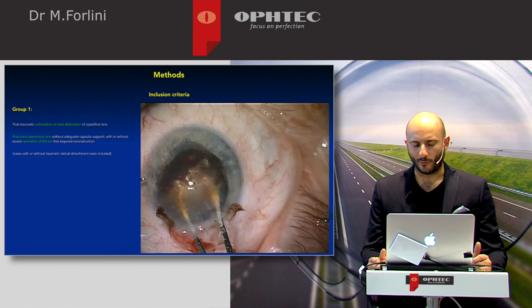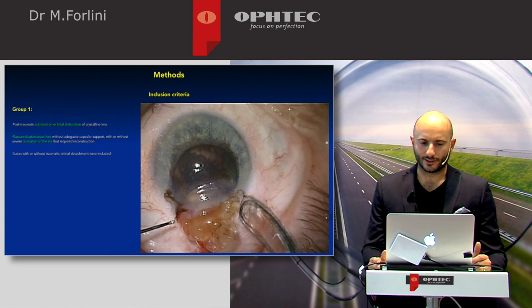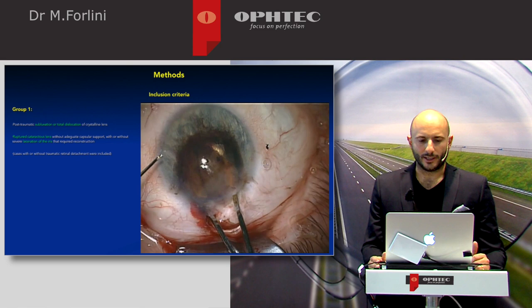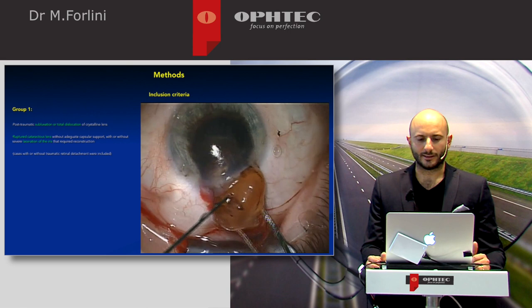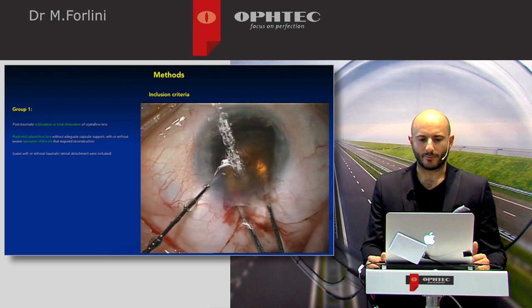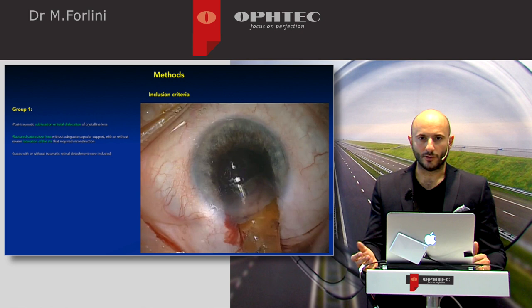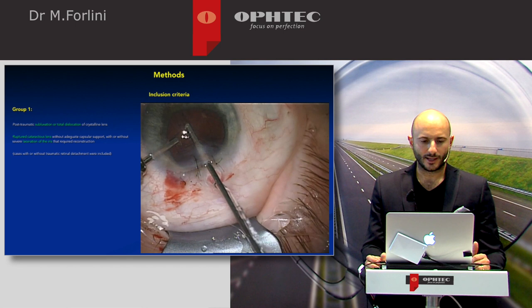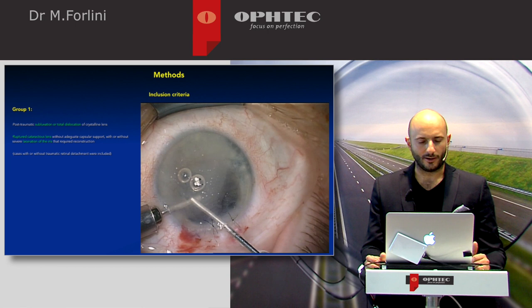We started with FAGO, but we had to convert the technique to intracapsular cataract extraction in order to avoid the pieces of the nucleus falling down in the vitreous chamber. We had to open the corneal wound and tried to remove all the pieces of the nucleus outside of the anterior chamber. After that, anterior vitrectomy with triamcinolone to stain the vitreous.